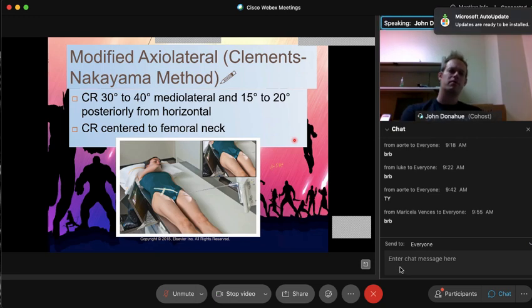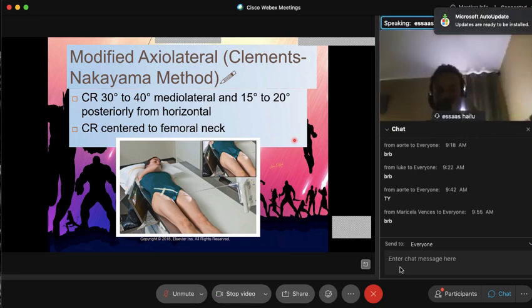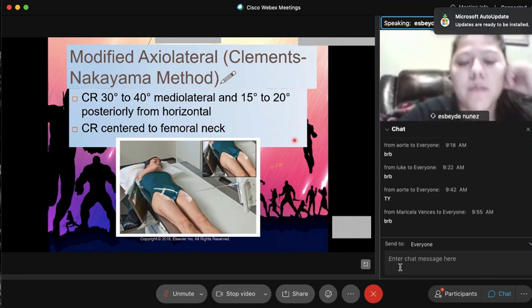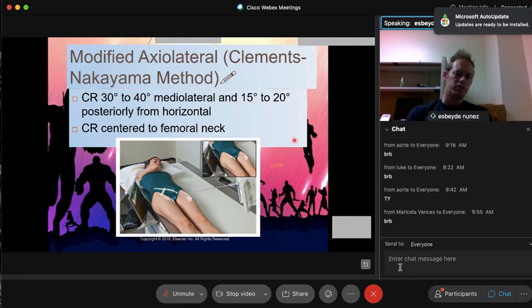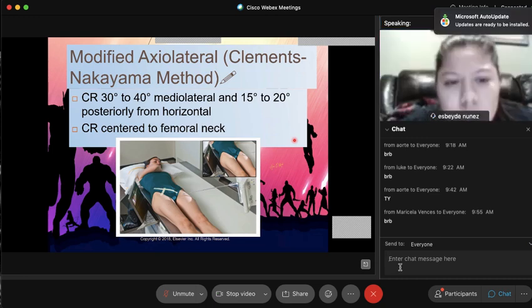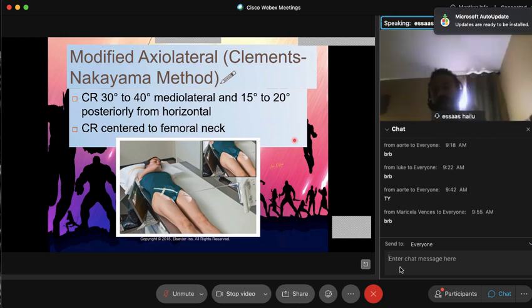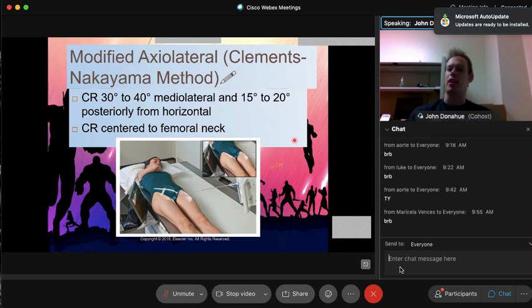Think about it. I mean, bilateral fracture. Not exactly. The clue is in the name itself. Look at the position of the patient. Look at what we're doing with their central ray. Say again, Ms. Betty. Well, I was thinking of trauma. They can't move. You're on the right track. So think back to that Danelius Miller. Ringing any bells? They cannot lift up their leg, maybe. There you go. So this is basically a modified version of the Danelius Miller.